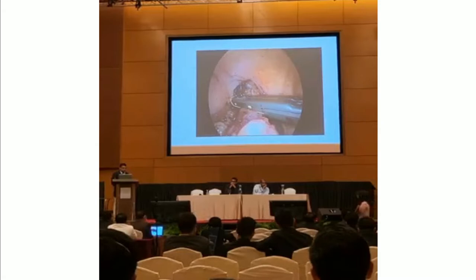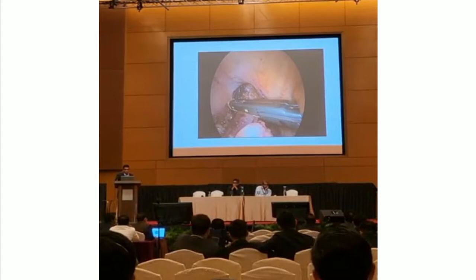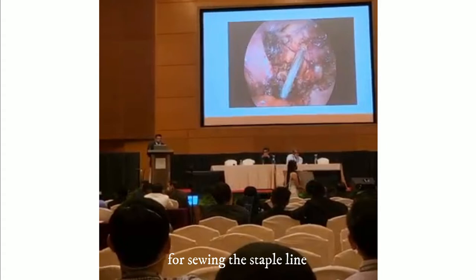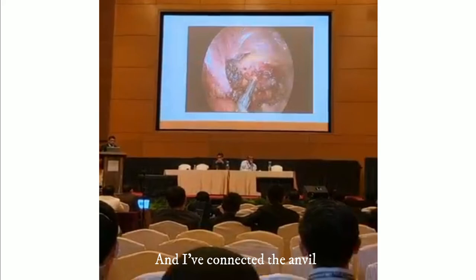There's still some tissue there, so I've got my second stapler to fire that off and complete it. Once I've completed that, you can see my circular stapler coming through, for sewing the staple line. And I've connected the anvil.